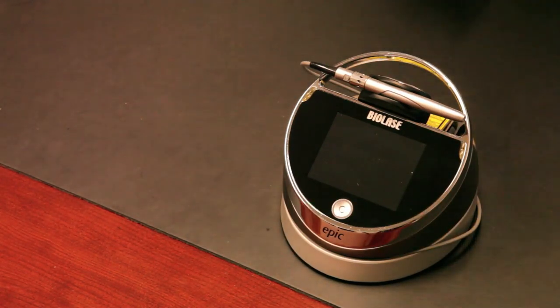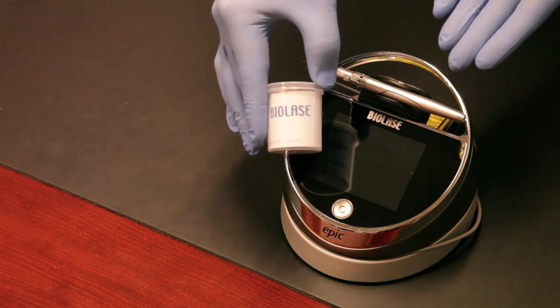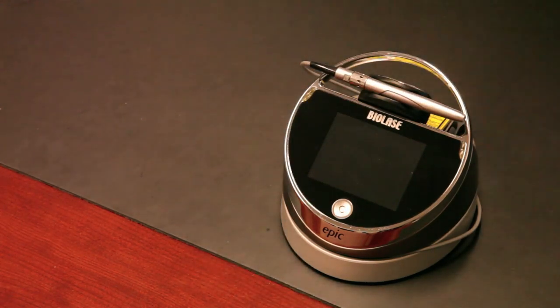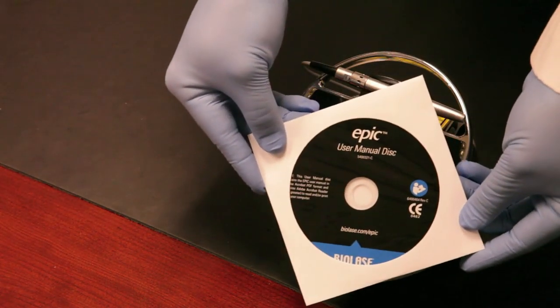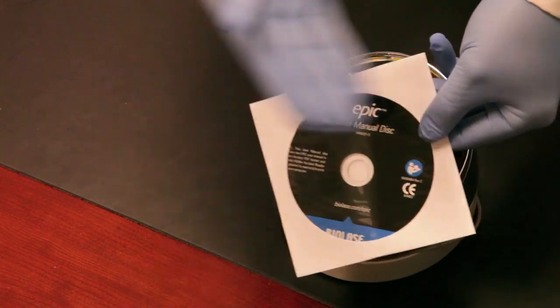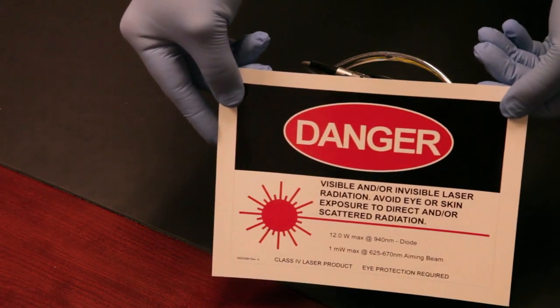There's also a tip initiation kit. When you use the laser to cut soft tissue, you have to initiate the end of the tip, which means darkening it — that's what this kit is for. Also included are batteries for your foot pedal and the user manual, which ships on a disc. We highly recommend reading it before using your EPIC laser.